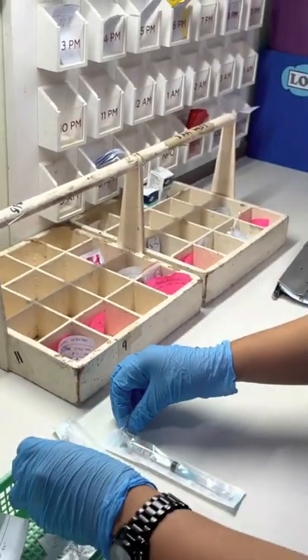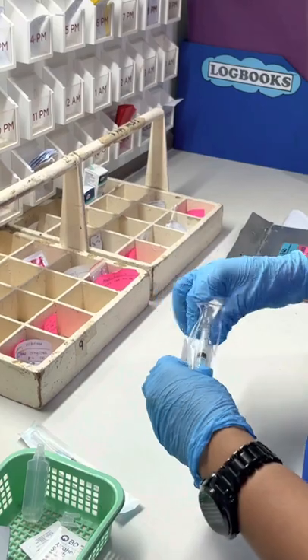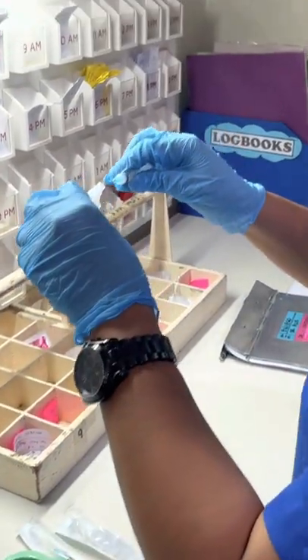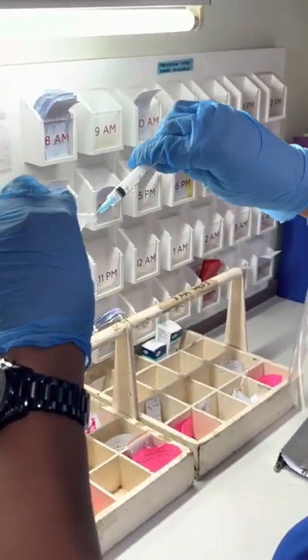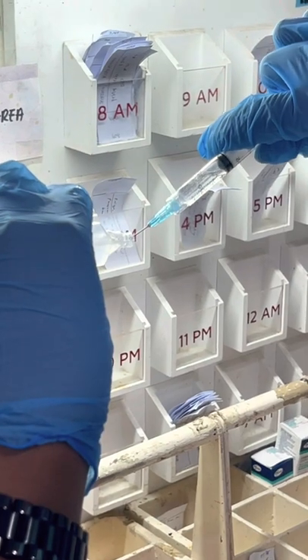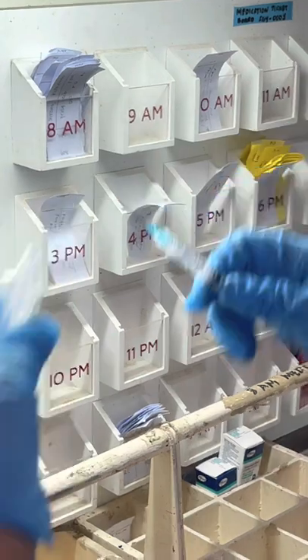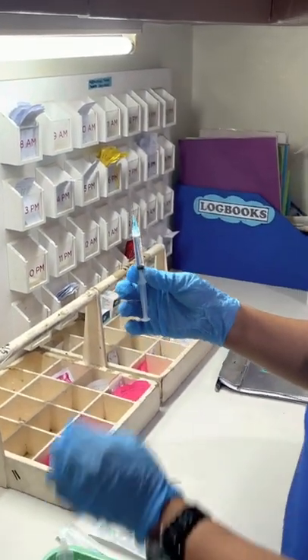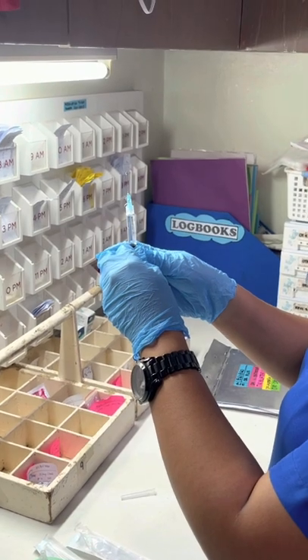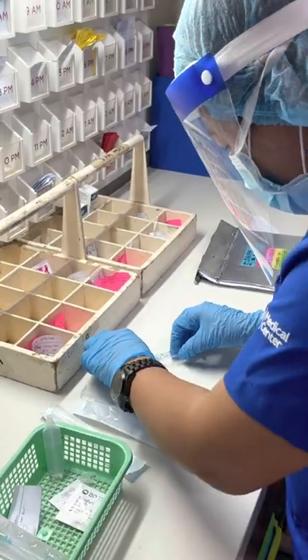Now we are going to prepare sterile water for injection as flushing. Or if you have plain normal saline solution, you can use that instead. When withdrawing from that ampoule, make sure it is at eye level. Do it gently, and ensure the bevel is facing down. Then remove the air, because you will be inserting the sterile water for injection or plain NSS into the heplock later on.